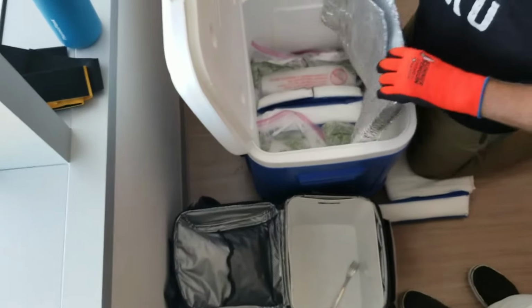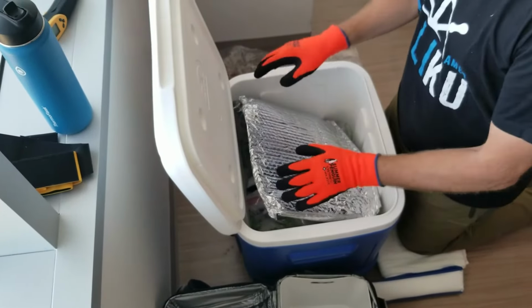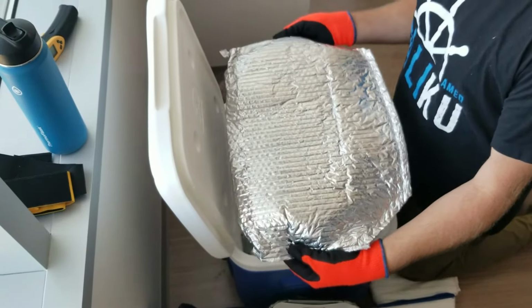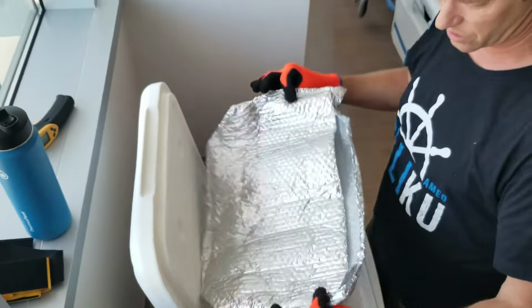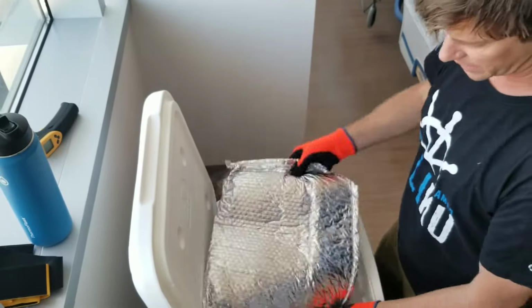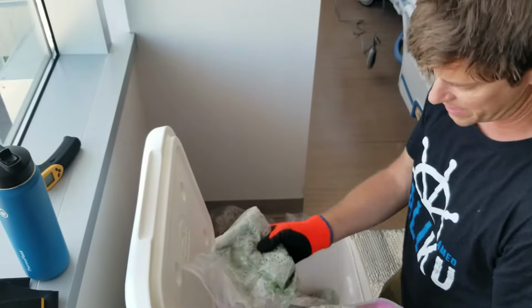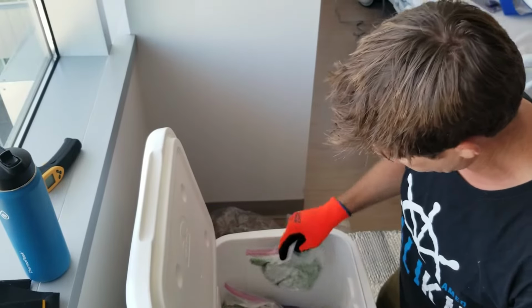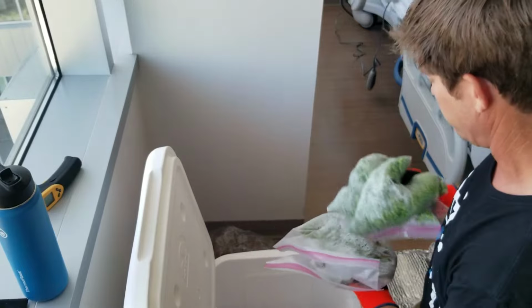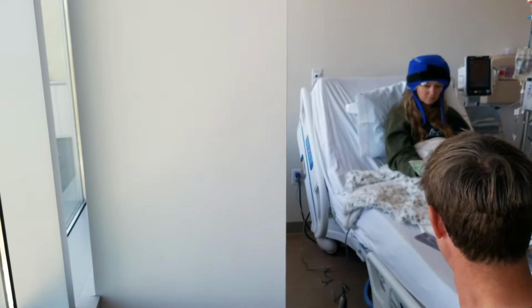After I learned a little bit more, I didn't even fuss with that, because you don't need to do that. I think somebody sent some Godiva chocolate, so this is just like a Mylar blanket. The first time I just used a towel, so that's just to keep the heat in. I've got the peas in here, and we use those for her hands to help with the chemo neuropathy. So she's ready for a new set of peas, and put that there. And that kind of helps.